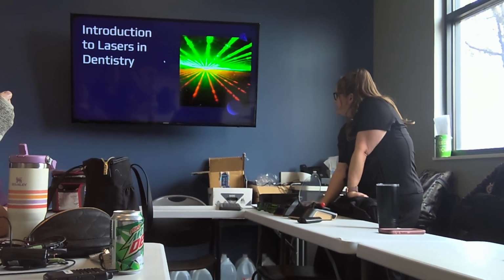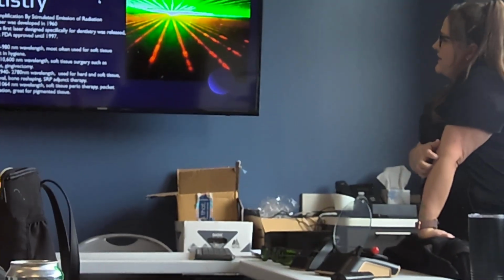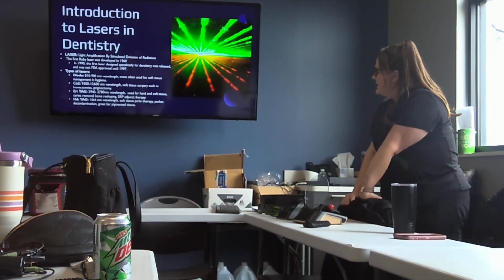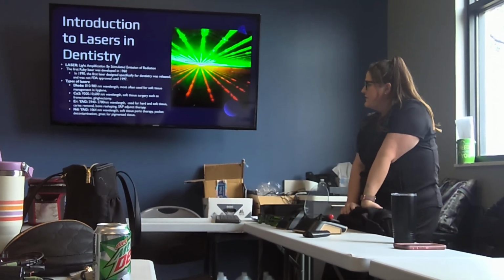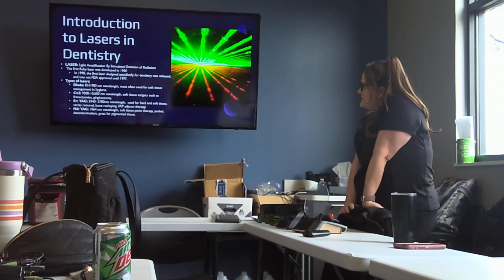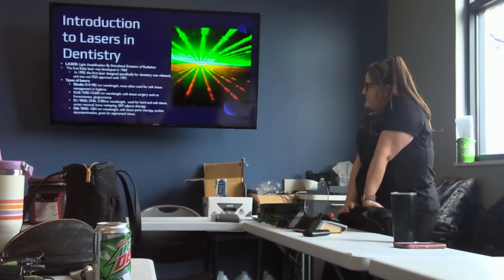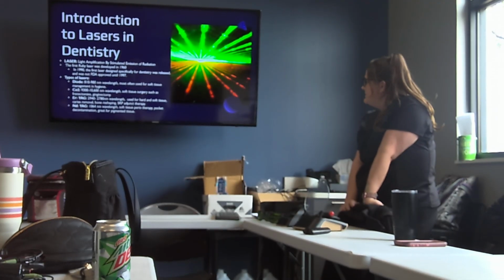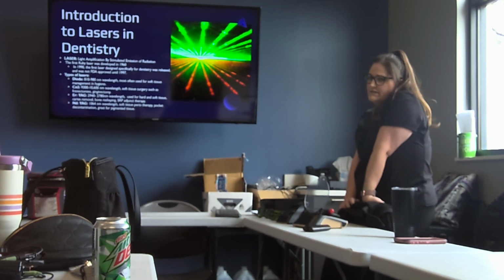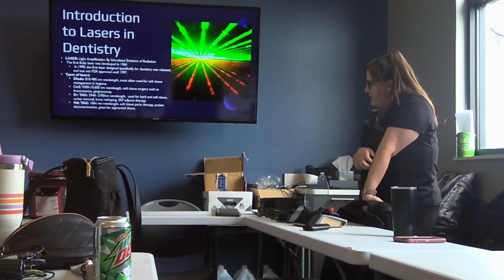So, introduction. Laser stands for light amplification by stimulated emission of radiation. The first laser was developed in 1960. It's called the ruby laser. It wasn't until 1990 that the first laser was designed for dentistry. And then the FDA didn't approve lasers until 1997. So they've been around a while.